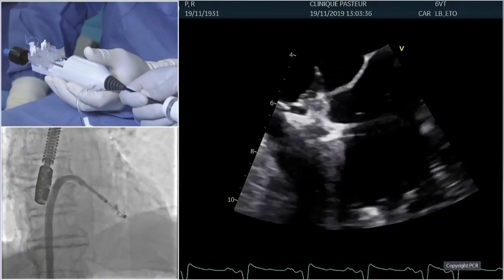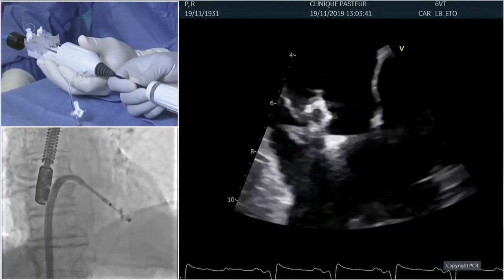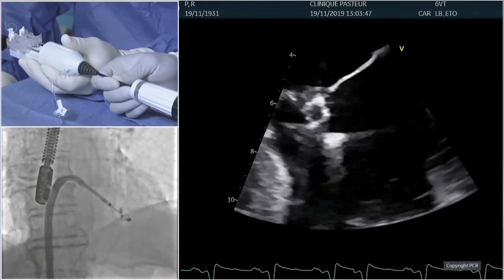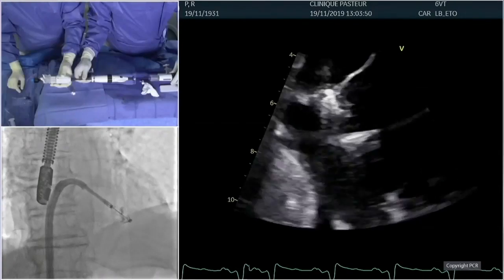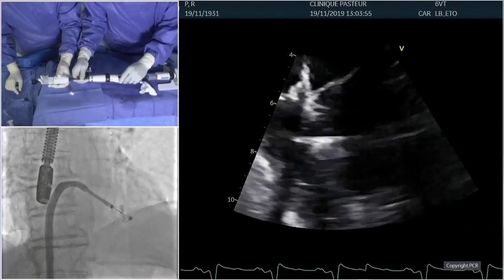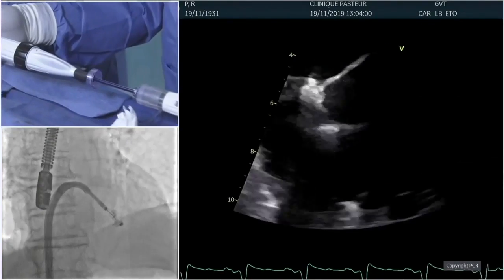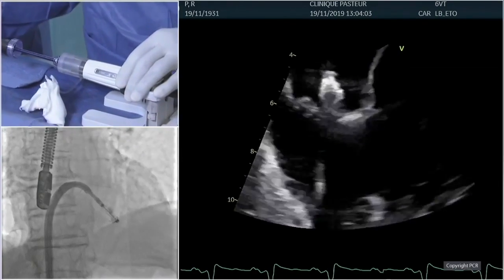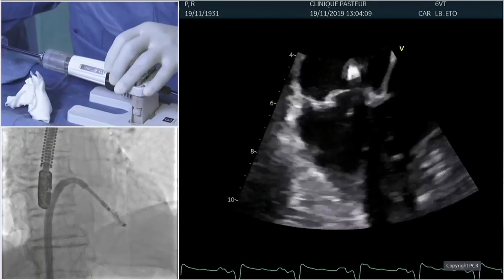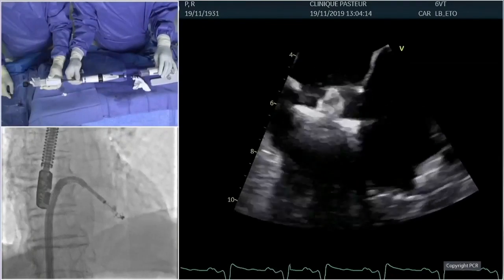So we will take time. So maybe Didier, we can also try a slightly different position in order to be a little bit more perpendicular, and to change the trajectory to anterior position could help. Exactly. In half of our cases, we did an independent leaflet grasping, and we started with the anterior leaflet because it's much longer, and you have more possibility to change the trajectory as long as you have captured the AML.